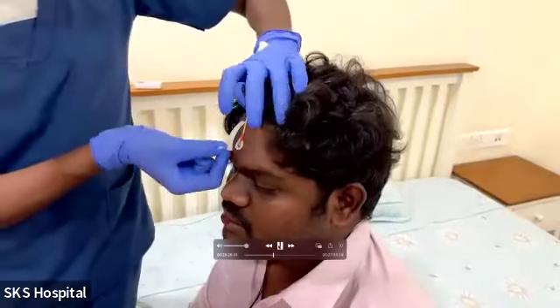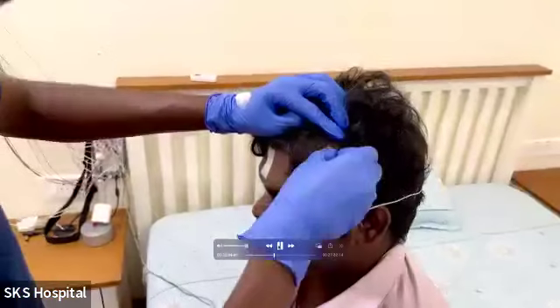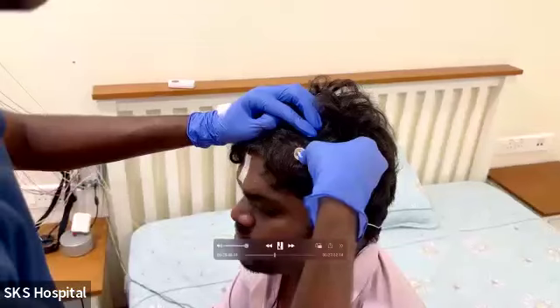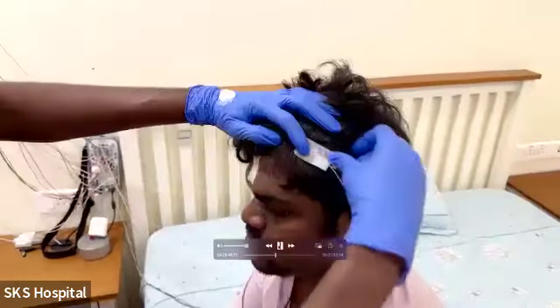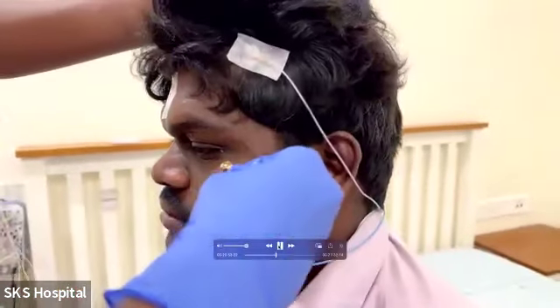After using the low impedance gel, we'll fix it with a micropore so that it doesn't fall off. Though saying it is very easy, it's actually very difficult for us to connect and fix it for the whole night so that the recordings are perfect. That's why we have backup leads, so that if one of the leads fails, you don't need to go and reconnect it every now and then. You can keep scoring as long as you have the backup leads, without any interruptions.